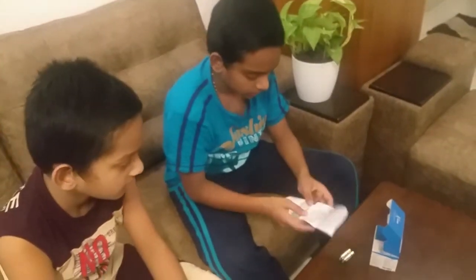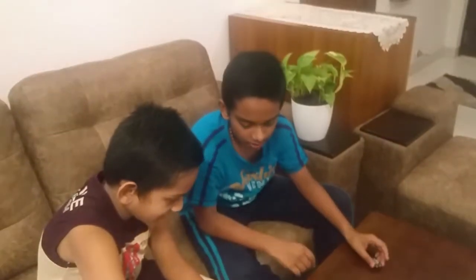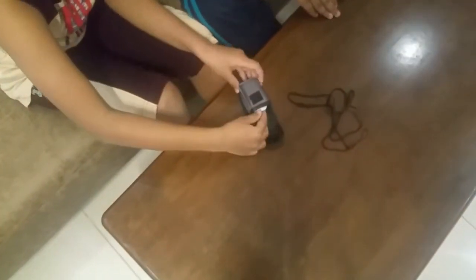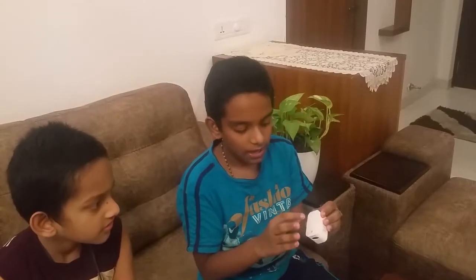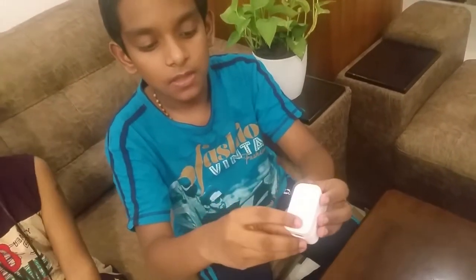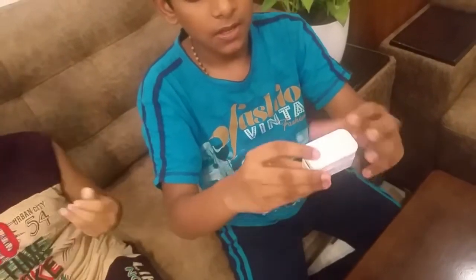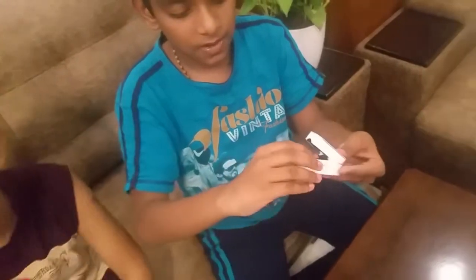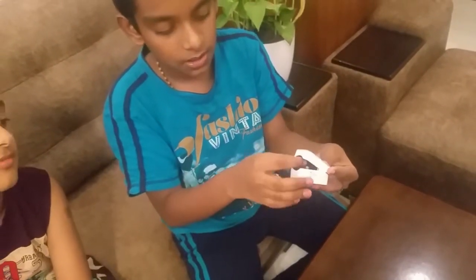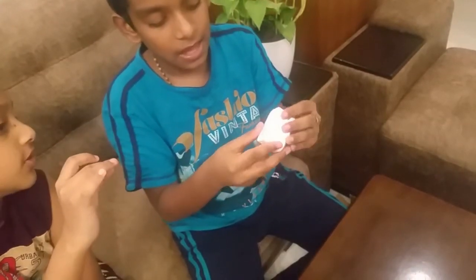Now let's open our oximeter. So guys, we have our oximeter over here. We have our LED screen and the power button over here. This is the place where we put our finger, and we have two sensors over here which measure our oxygen level and our pulse.